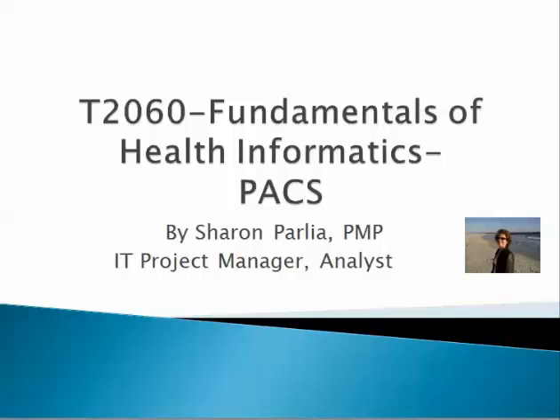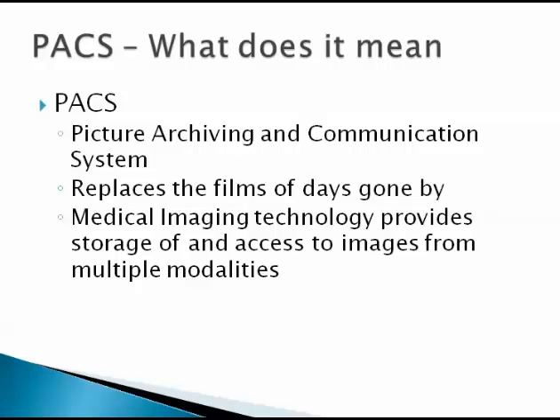Today we're going to review Module 3, where we're going to talk about a PACS system. So many of you have heard of a PACS system, but what does it mean? What does a PACS system mean?